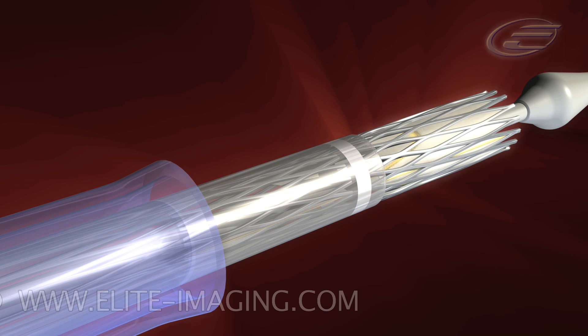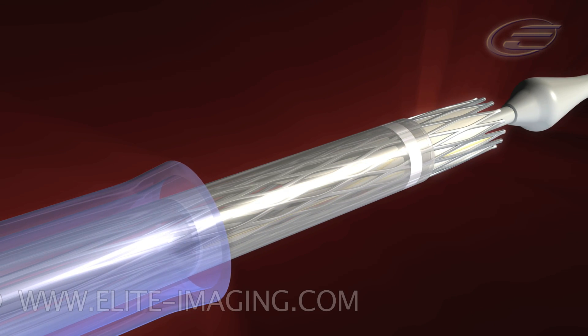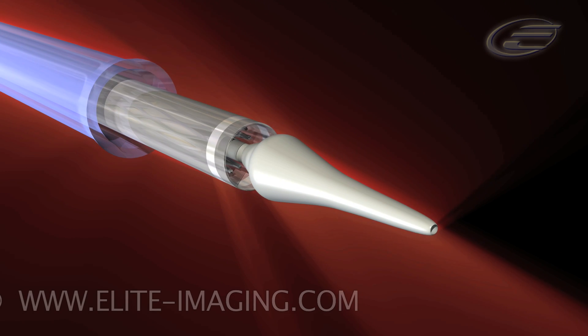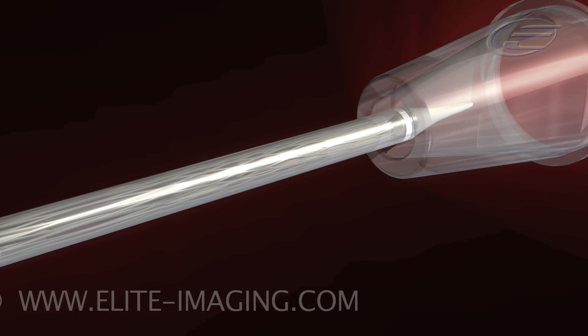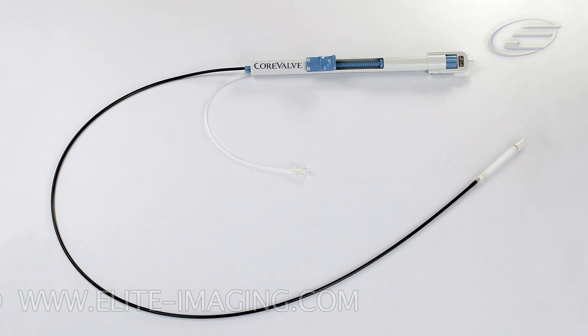Continue to load the valve carefully using the micro-knob and outflow tube. Continue the loading process by advancing the catheter sheath. Before using the catheter, remove the outflow tube and outflow cone. The CoreValve Revalving System is now ready to be used.